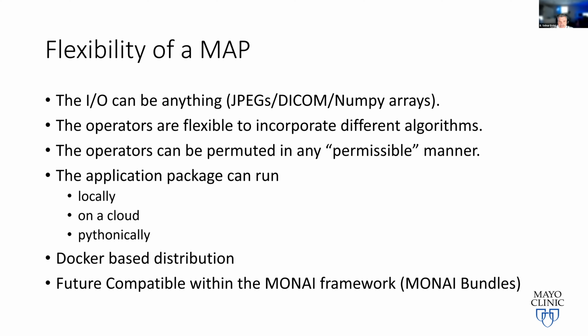And those operators can be chained in a directed acyclic graph in a permissible manner to pass one dataset to the next operator. You can create a flow. Then it can run. What you described can be executed again, I like to stress this, locally, on cloud, or Pythonically.